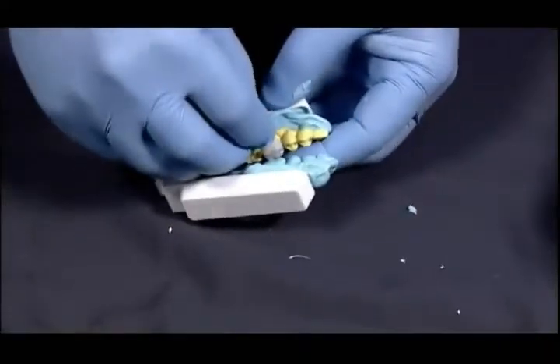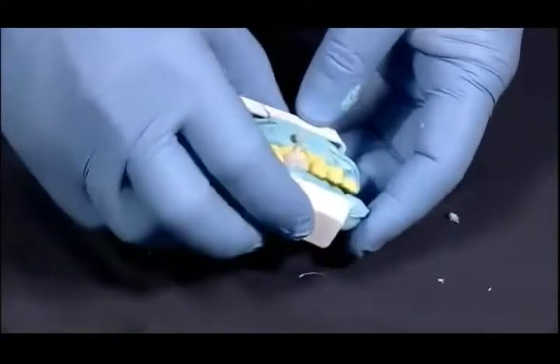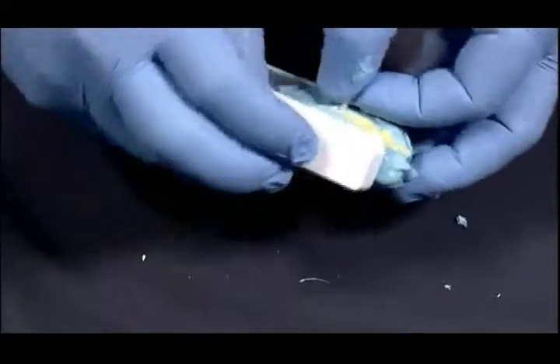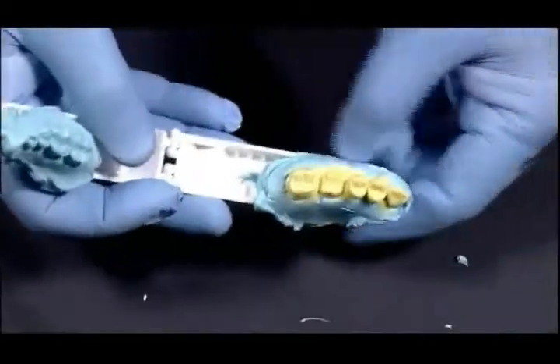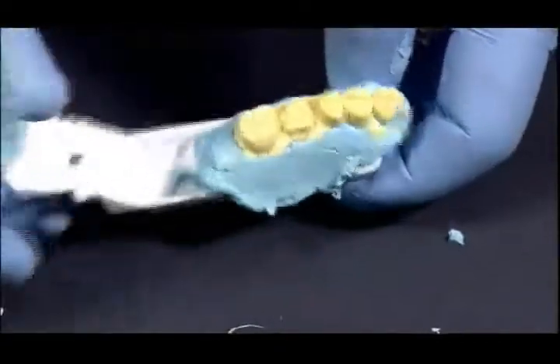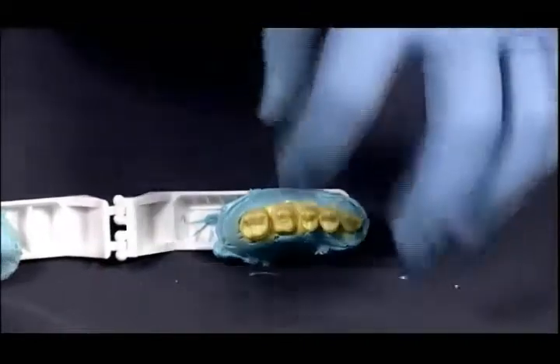Now we'll try it on, and we'll notice that it's just a little bit too tight for us to get the articulator closed down all the way. So we will trim that. One of the things I want to do before we go to the trimming process is, if you could zoom in on this, I'd really like to show the detail of that impression, or actually of that model work. The detail is, I think, quite exquisite, and it was done in a matter of minutes. All right, I'm going to set that off to the side, and I'm going to go trim this just so that it'll sit down passively on the die.